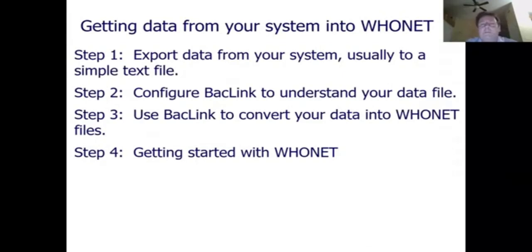The steps: instead of talking about BacLink, the first step is where did the data come from? People don't have trouble with BacLink once we help them or they go through the tutorials. So step one is to get the data out of your system, and then configure BacLink. You just do that once.